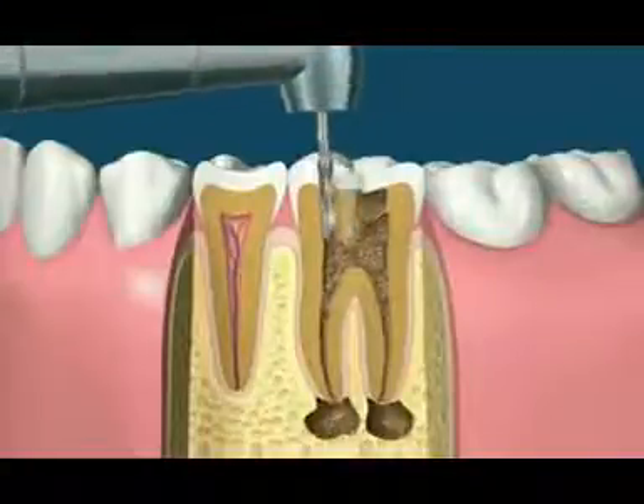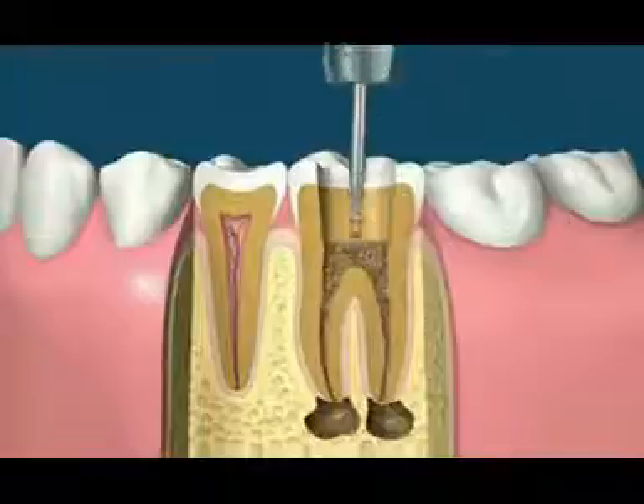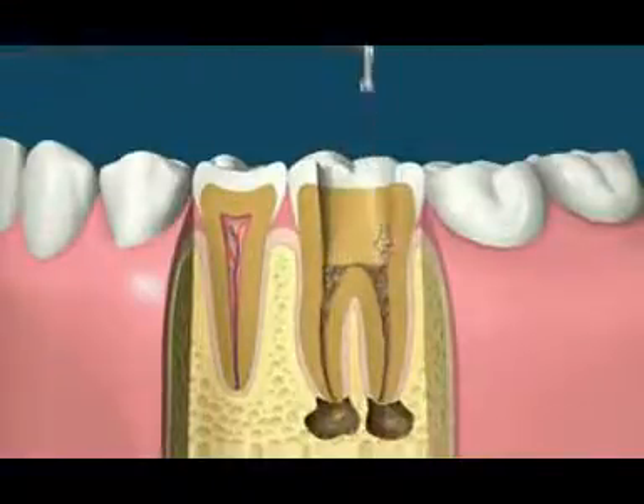Root canal treatment begins with the standard drill to access the inside of the tooth. Slower speed round drills can then be used to remove decay and to expose the canals.